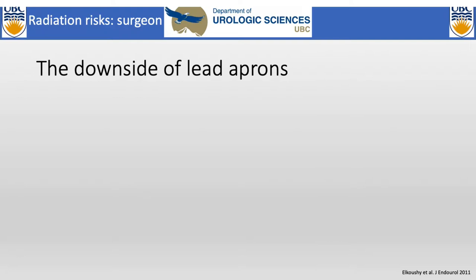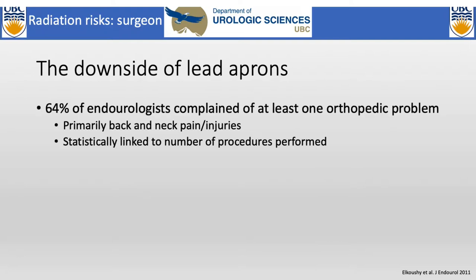Now, wearing a lead apron can be a little cumbersome. There's a survey done in the Journal of Endourology. 64% of endourologists complain of at least one orthopedic concern, whether it's neck or back pain primarily. The more cases they did, the higher chance they had of having this pain.